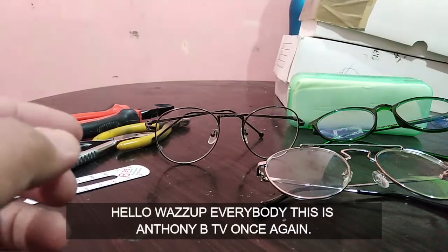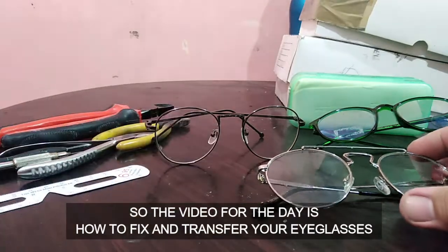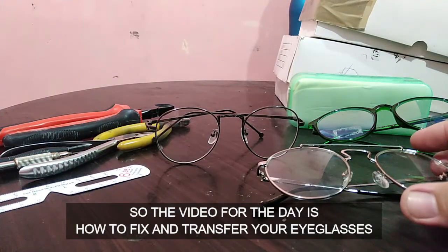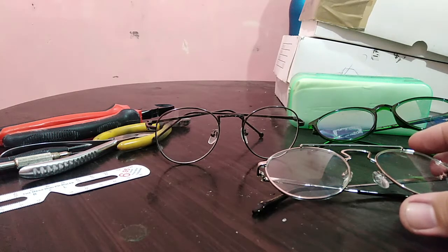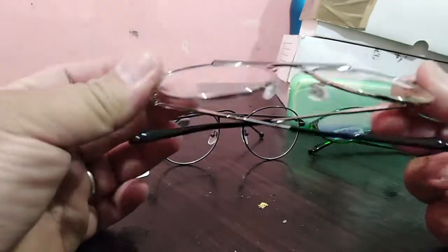What's up everybody, this is Anthony B TV once again. The topic for the day is how to fix your glasses — remove your lenses and transfer your eyeglasses into a new frame. We have three frames here, including a round metal frame.